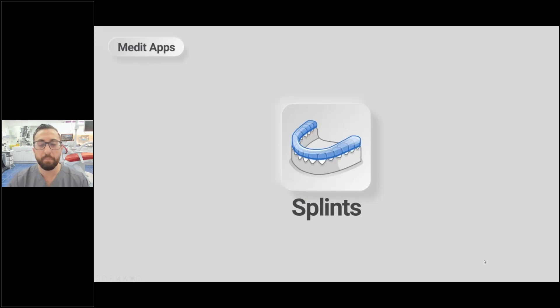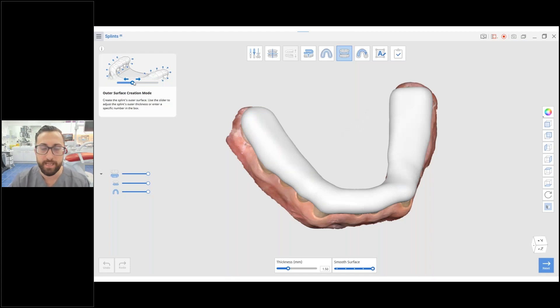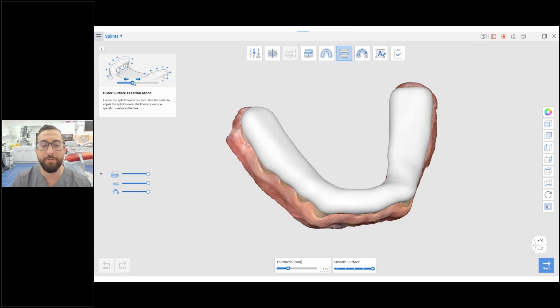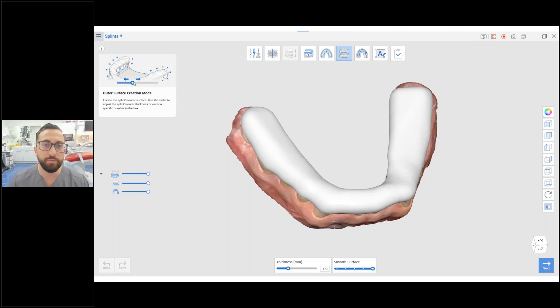Medit Splints is a popular app to quickly and efficiently make splints for 3D printing. You scan the patient, make a splint with a few clicks, and export it to your 3D printer. Medit has announced an integration with SprintRay, making it a very fast, efficient workflow. The key is delegation — you can delegate all of this to your dental assistant or support staff.